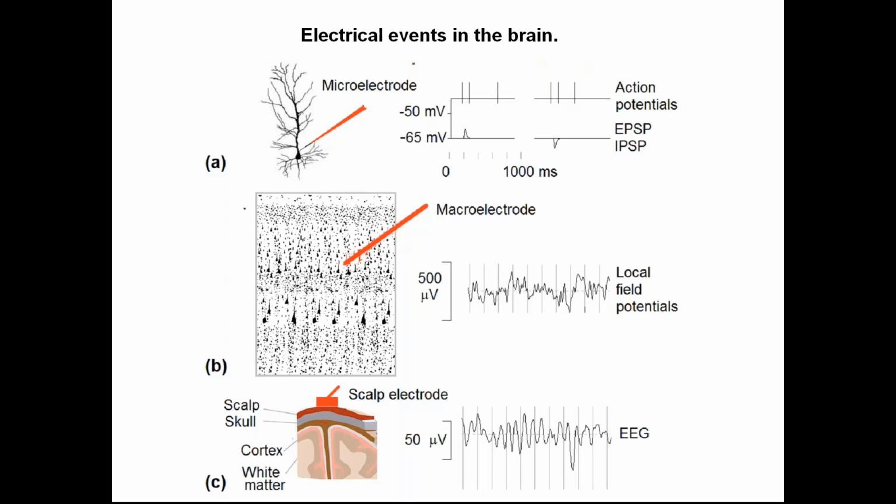So basically, by looking at EEG with the naked eye, it is almost impossible to say anything except seeing signs of epileptic foci. And as you know, EEG in neurological clinics is used mostly for epilepsy.